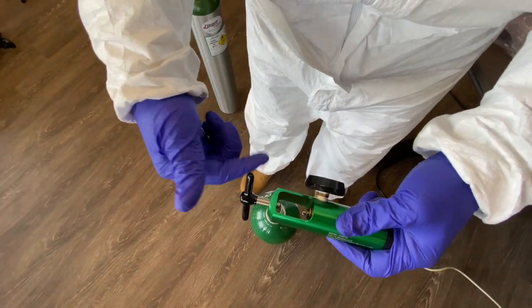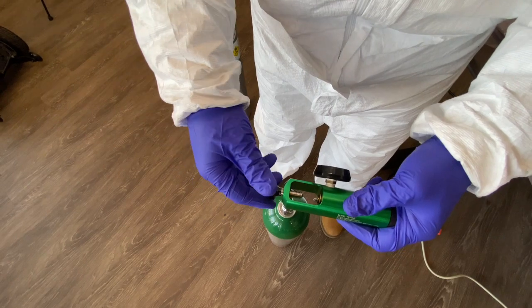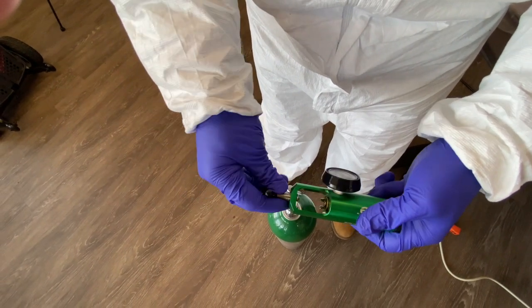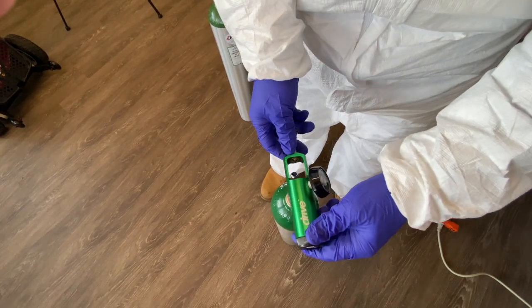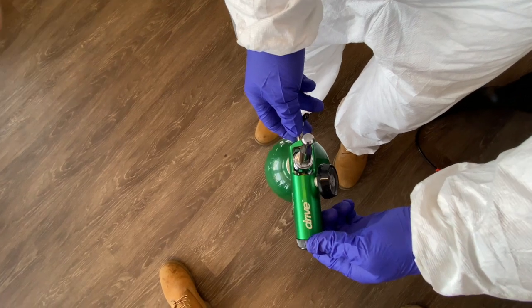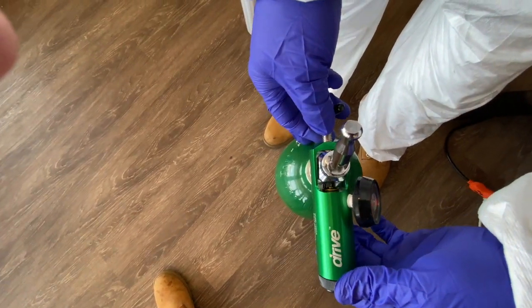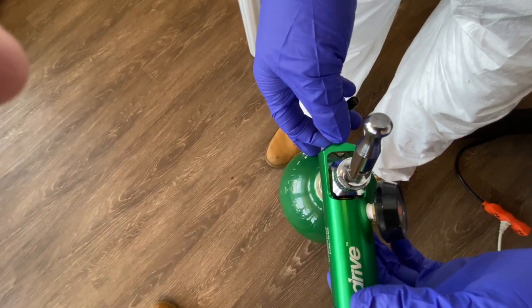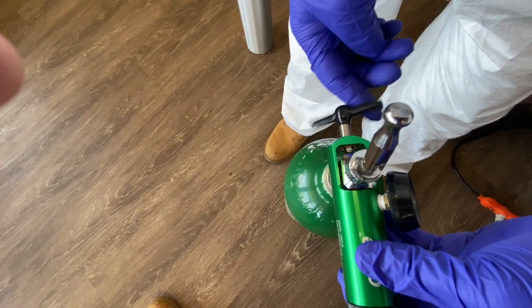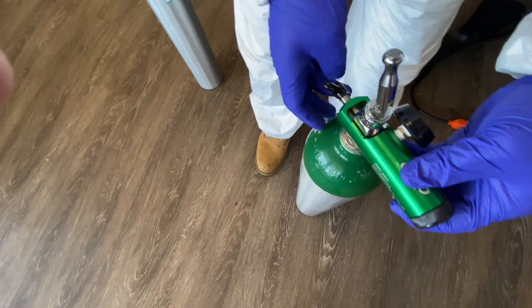I'm going to make sure — if your regulator comes like this, you unwind it to open it up and give yourself more space. Then I'll slide it down. Once I've inserted it properly, I'm going to go ahead and tighten it.